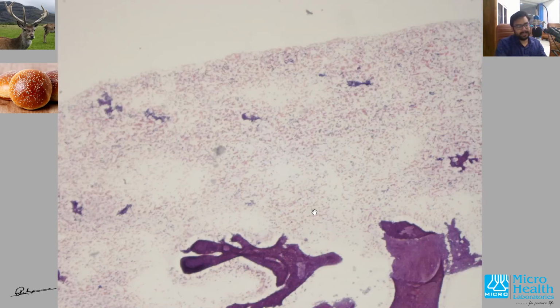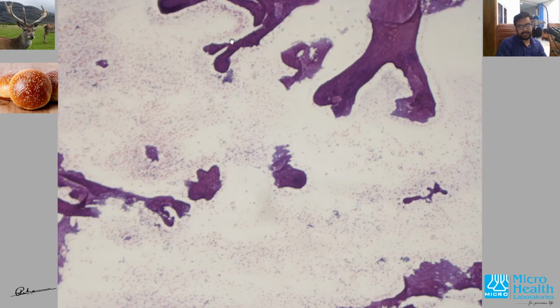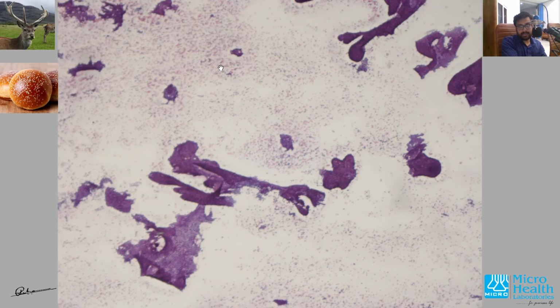These are basically ductal epithelial cells. So it is tightly cohesive clusters. This is a cluster, tightly cohesive, because these are actually cells. At higher power, when we go, we'll see that these are cells. So tightly cohesive clusters of cells, and also sheets. Sheet is what we saw in the beginning. Again, I'll have to focus.